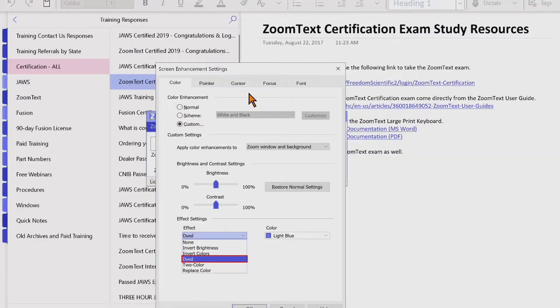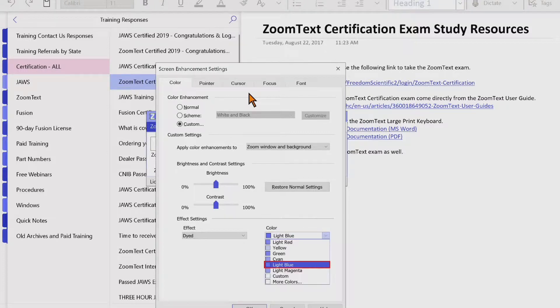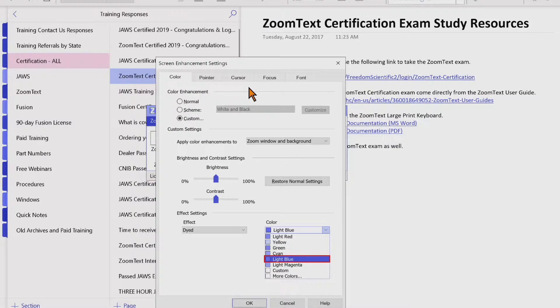Next is Dyed, which transforms all screen colors to a single hue while preserving their light and dark values. When the Dyed effect is selected, a color combo box appears allowing you to select the dye color. Options include light red, yellow, green, cyan, light blue, light magenta, or custom slash more colors.